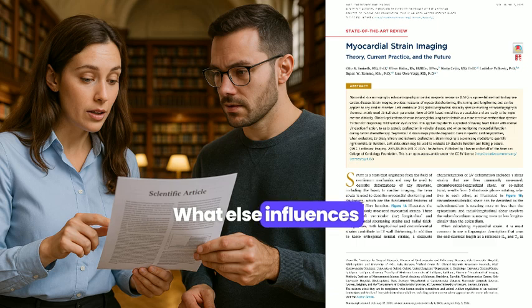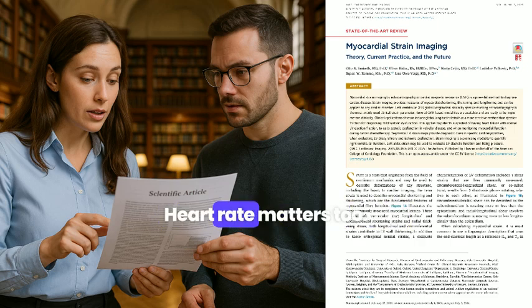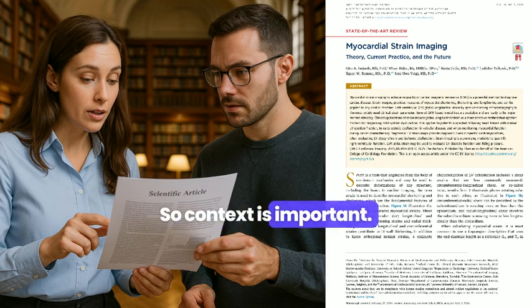What else influences the strain values we get? Oh, several things. Loading conditions are big: preload, how full the heart is, and afterload, the resistance it pumps against. Blood pressure, essentially. Heart rate matters too, and just the overall size and shape of the heart. So context is important. Very.